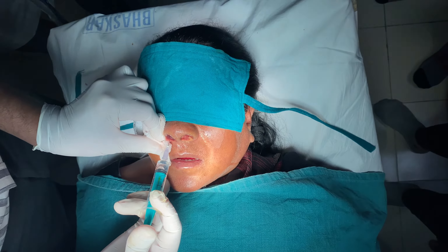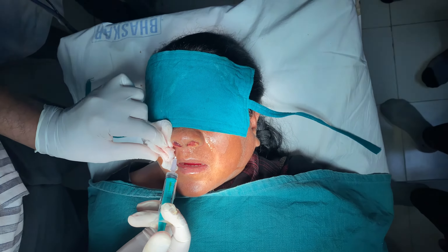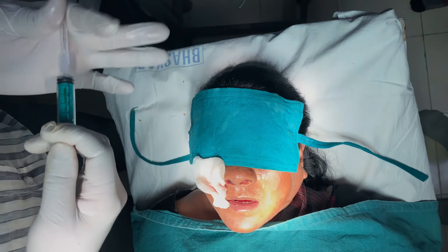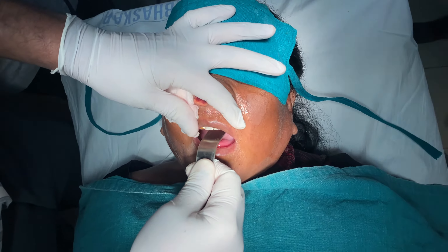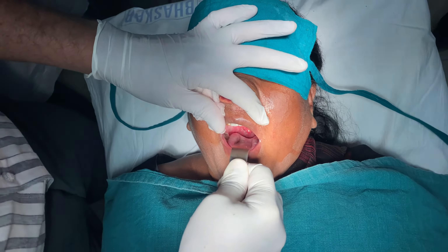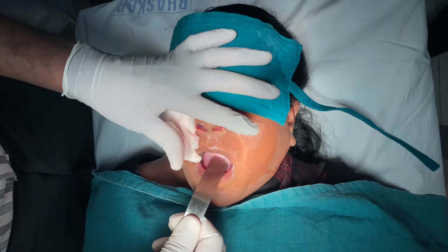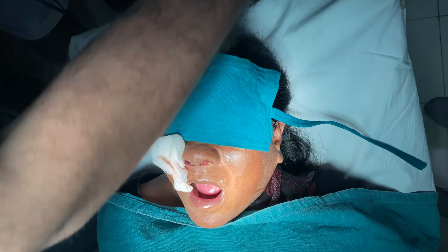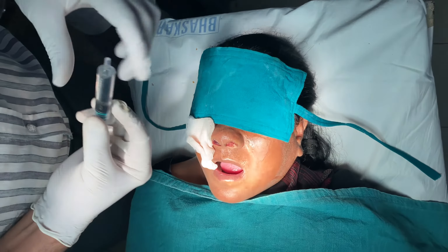You can inject almost 5 to 10 cc based on what is possible. Use the gauze piece so that it does not fall upon the face. Patient compliance is good. We should also check the posterior pharyngeal wall; if there is no bleed there, that is confirmation that posterior bleeding is not present. Intermittently you should check this.